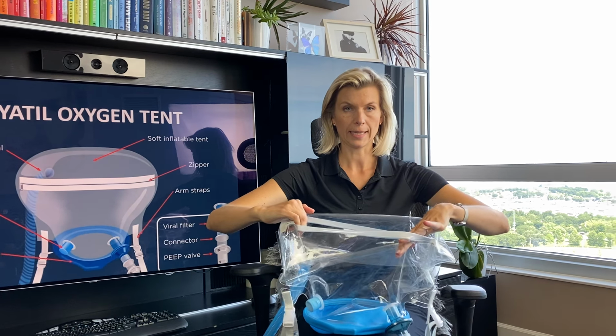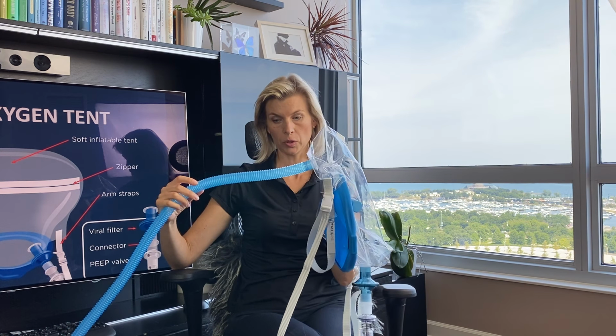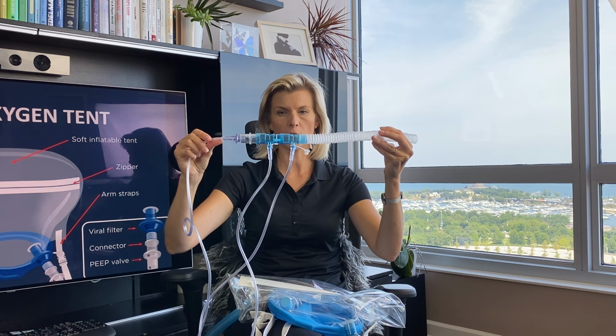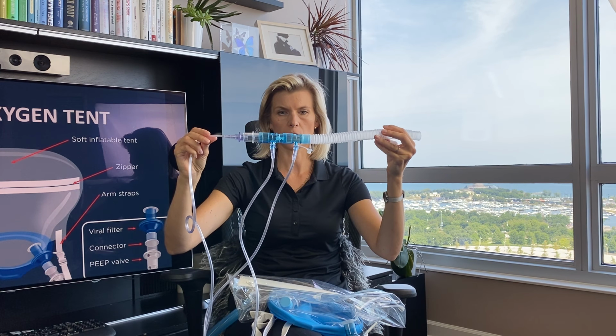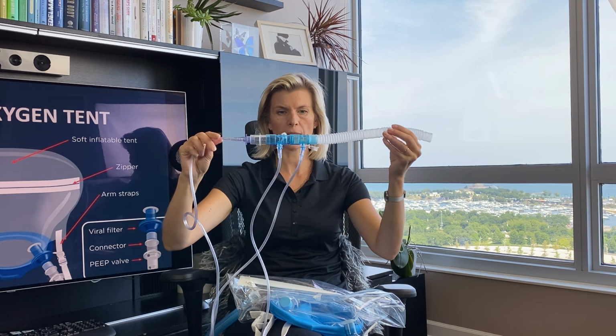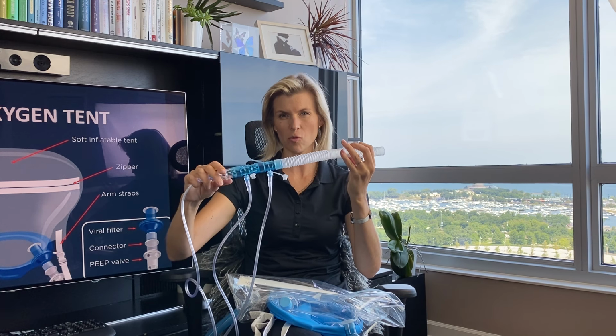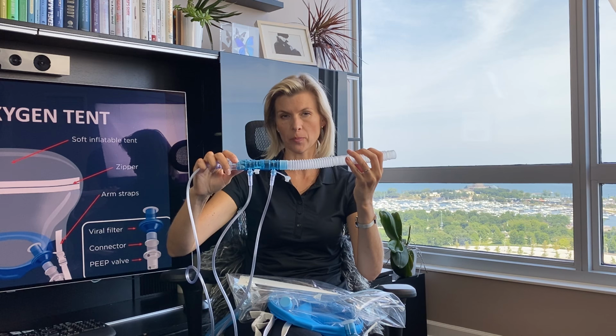Now I will demonstrate how to put it on. You want to make sure that the zipper is open. And for the input, as I showed in my previous videos, you have to make sure that it is connected to the wall gases. Here is a setup that I explained in the previous videos. You want to make sure that the flow is no less than 60 liters per minute.